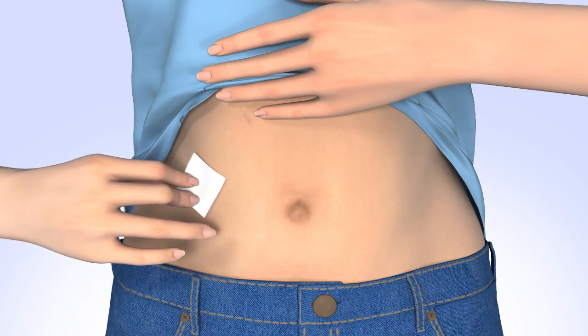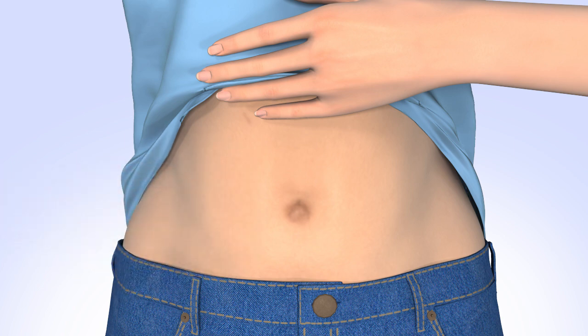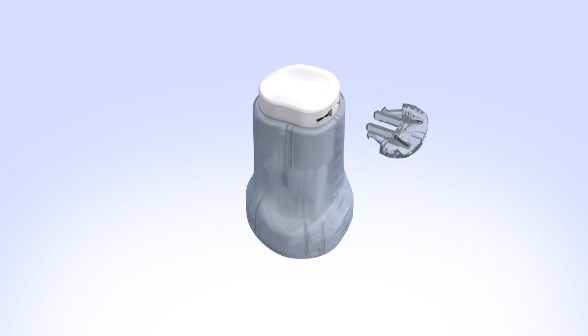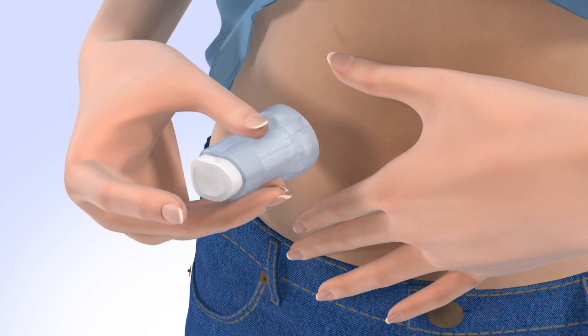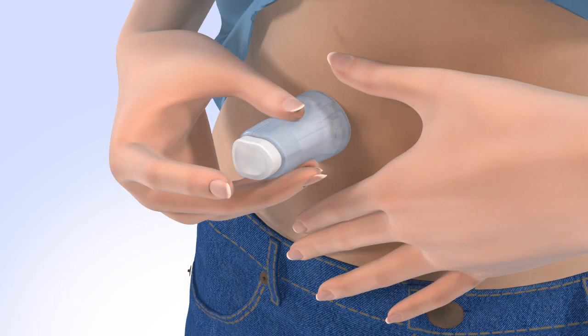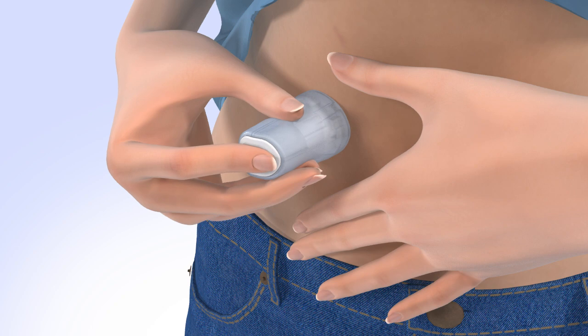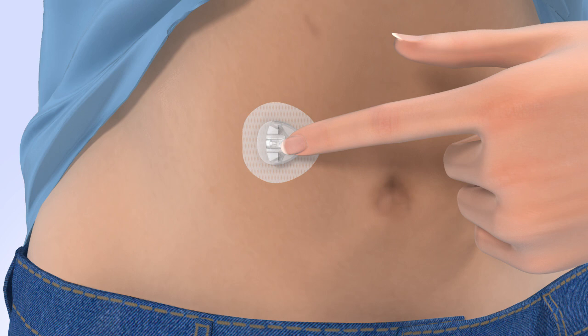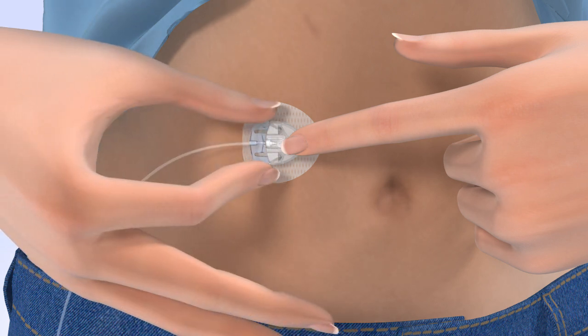Clean your infusion site properly with an alcohol wipe or prep wipe and allow your site to air dry. Pick up the insertion device and remove the paper backing, being careful not to touch the adhesive. Remove the disconnect cover by gently squeezing the sides and pulling it away from the insertion device. Store the disconnect cover for later use to protect the cannula housing when disconnected. Stretch the skin until smooth. Place the insertion device on the site you have prepared — the raised arrows indicate the side where the tubing will be connected. To insert, firmly press the top button, then carefully pull the insertion device away from your body. Safely dispose of the used insertion device, and smooth the adhesive onto the skin.